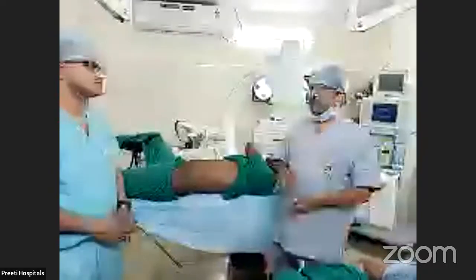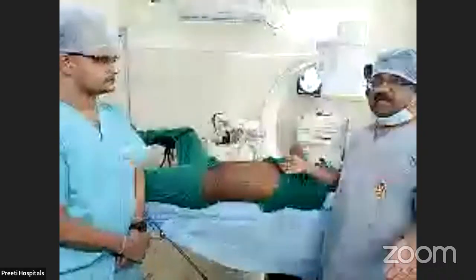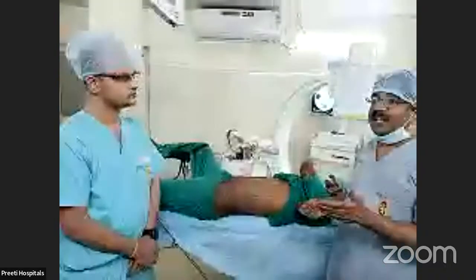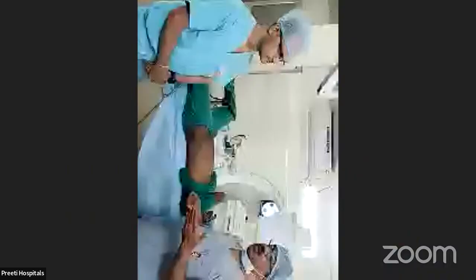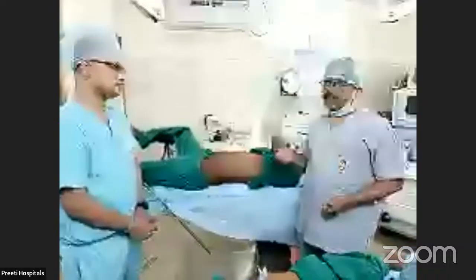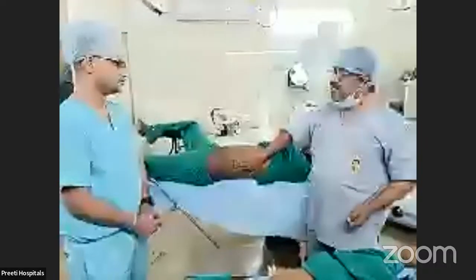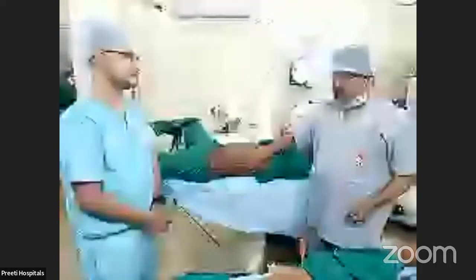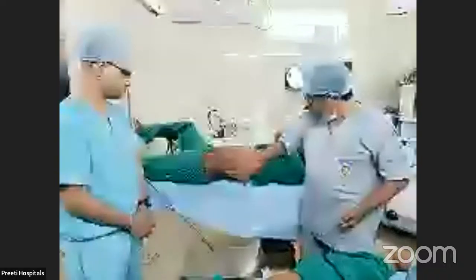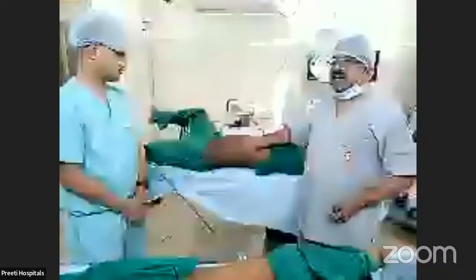So now we are talking so much on supine. Now if you discuss all the cases, more tendency is towards which side? Prone PCNL. Because we are used to it, we can remove easily, the length of the tract is less, and special training is not required. Here, posterior axillary is variable. That's why, what is the other landmark you say? Tip of the 12th rib. If you take tip of the 12th rib but 2 fingers below, you will be very safe. But still, these landmarks are slightly variable.